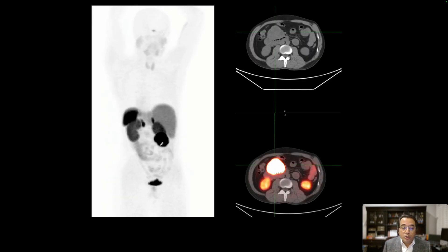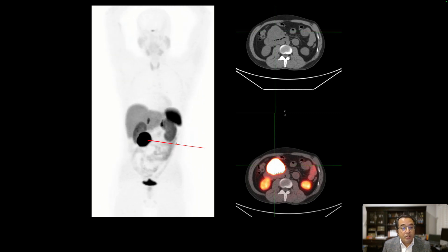The rotating image shows that there is intense uptake in the mass, and the rest of the scan shows that there is no evidence of metastatic disease. There is physiologic uptake in the pituitary, spleen, liver, adrenals, and excretion from the kidneys into the urinary bladder.